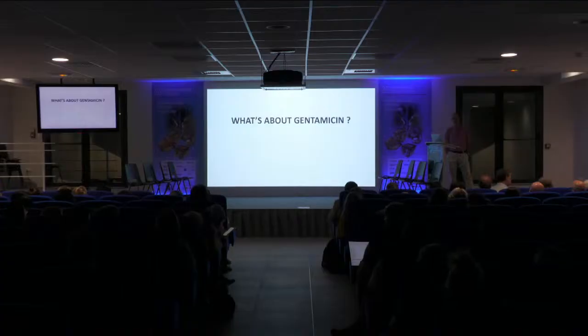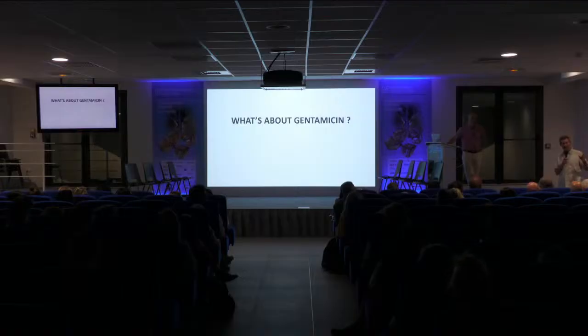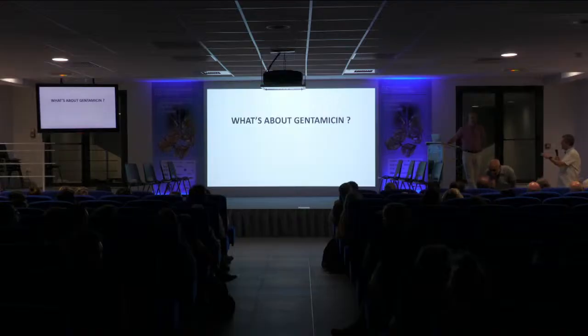At the Prosper Ménière Society, it was also discussed as a primary choice in Ménière disease compared to endolymphatic sac surgery, which we also do in combination with cochlear implant. We did a study in Melbourne where we retrospectively reviewed retrosigmoid and translabyrinthine acoustic cases and looked at the MR signal. The degree of fibrosis that occurred was variable, and also variable in the delay. Sometimes they were fibrosed within a few months, and then you'd have trouble putting a cochlear implant in, and sometimes 5 years later they still had good signal and you could do an implant. And I've had one case where a lady had a labyrinthectomy 10 years earlier and we were able to do a cochlear implant.